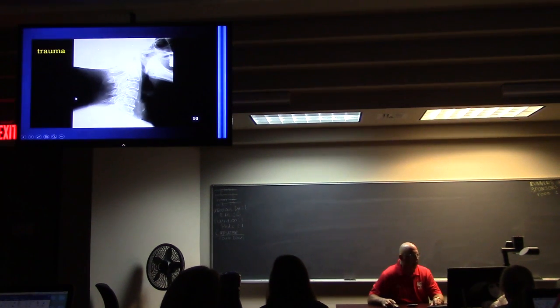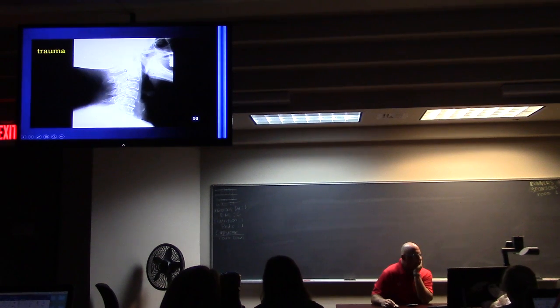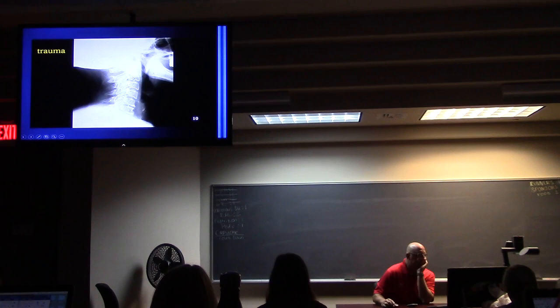There's a lady coming in from a car wreck. This is her first x-ray, and she has a neck collar on, so a C collar, so we're going to try to rule her out. 2, 3, 4, 5, 6, 7, anterior vertebral line, posterior vertebral line, spinal laminar line, tips of the processes. I really can't see the ring at C2. Just can't comment on that.